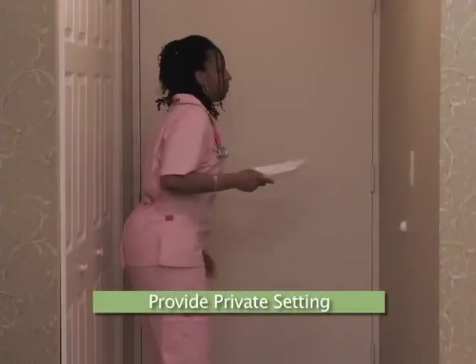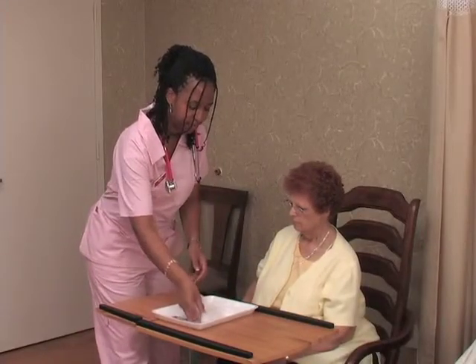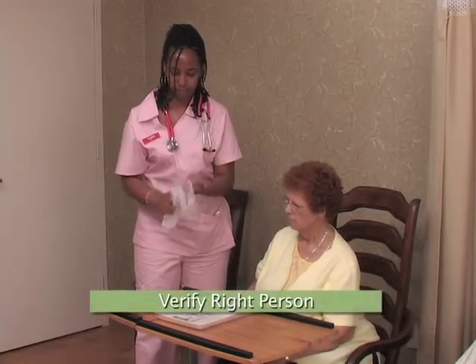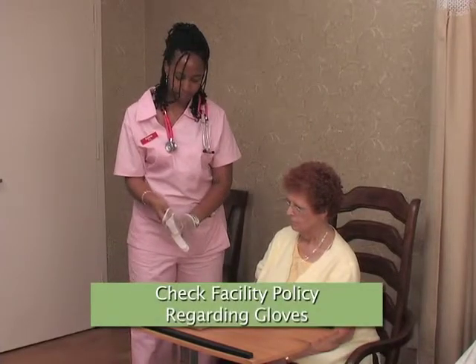She ensures Mrs. Manfrey is in her room to provide a private setting. With the gloves, gauze for cleansing, and the patch secured on the barrier, our nurse approaches Mrs. Manfrey and verifies her identity by following the employer policy for resident identification in her facility. This facility requires gloves be worn during patch administration, but your facility may not. Be familiar with your facility policy.